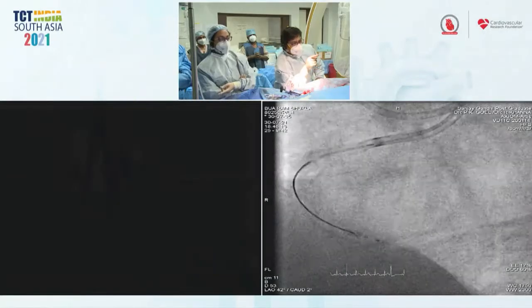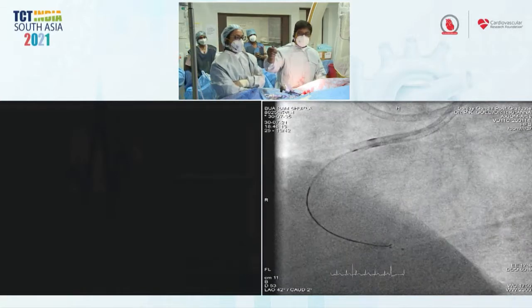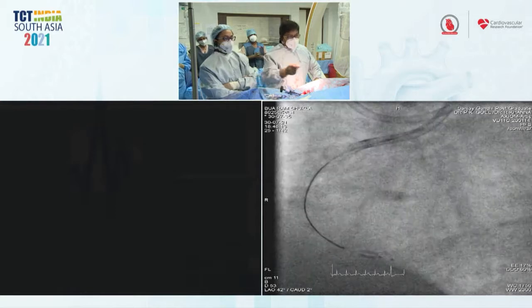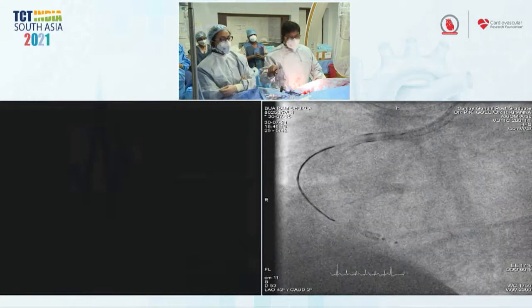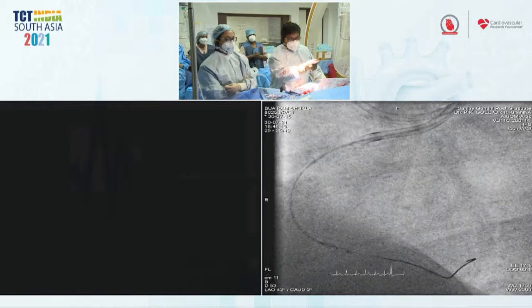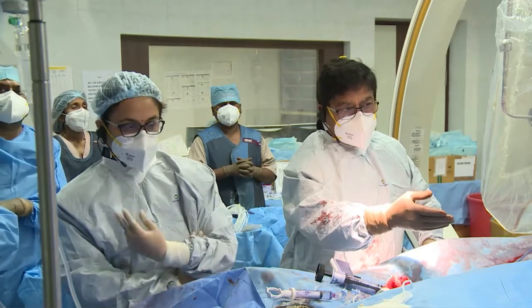So which wire is this you're using? This is the Stingray wire, the Stingray. Okay. And then this is the Pilot. Now that I have gone, with the Pilot you have the liberty to play with it, because it is not as damaging. So the Stingray wire made the hole, made the connect through the proximal hole into the main artery, and the Pilot wire followed that track, and beyond now it is fine. So now that's the Pilot that has gone in.